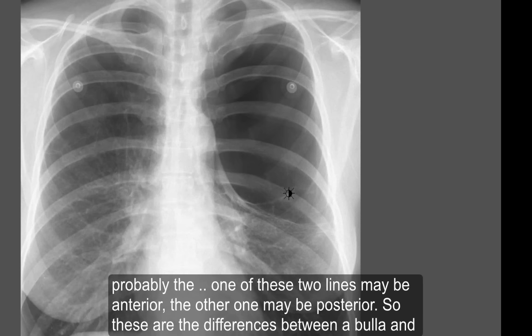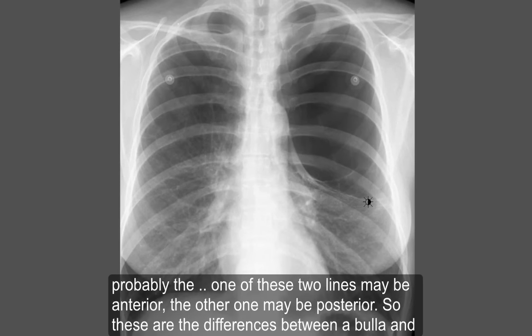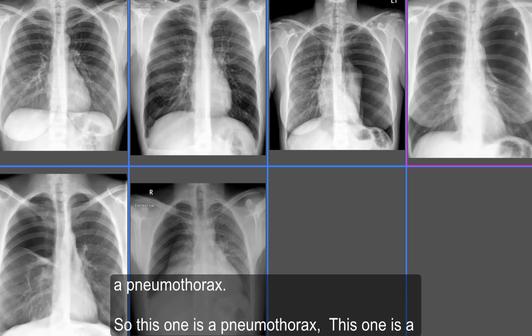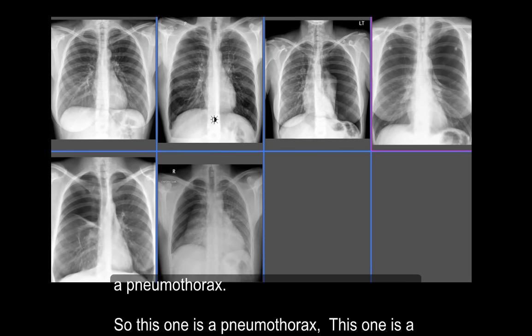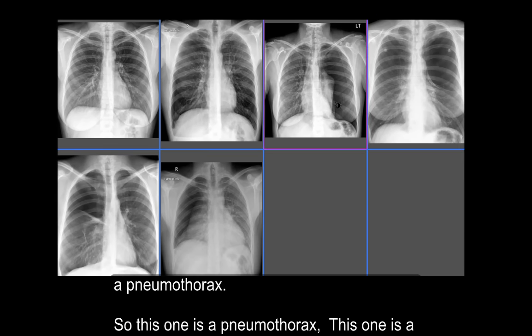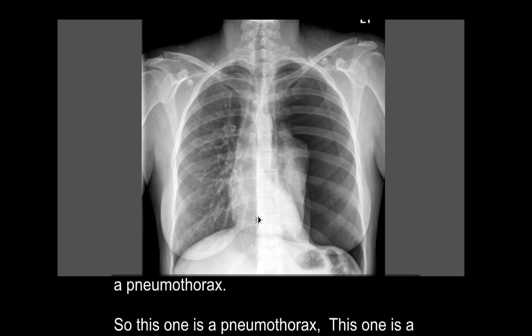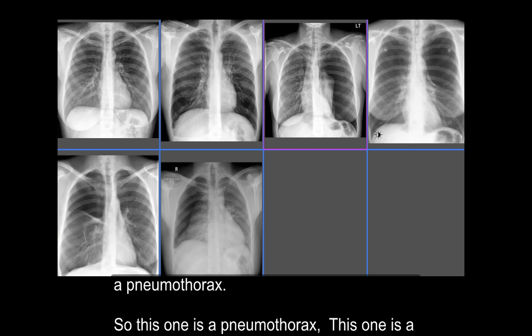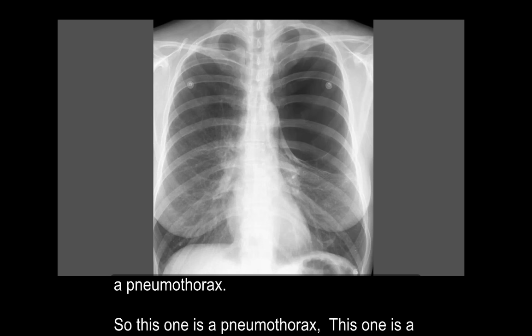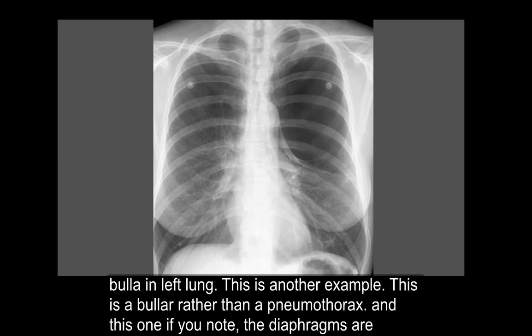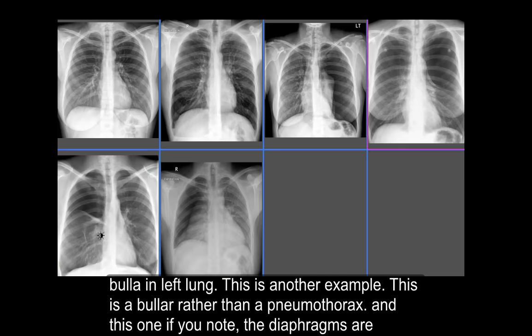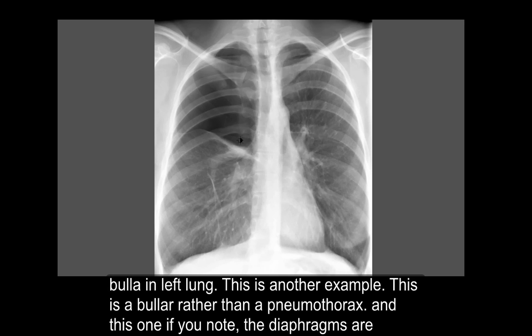One of these two lines may be anterior and the other may be posterior. These are the key differences between a bulla and a pneumothorax. So this one is a pneumothorax, and this one is a bulla in the left lung. Here is another example.